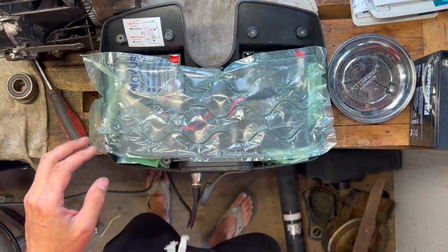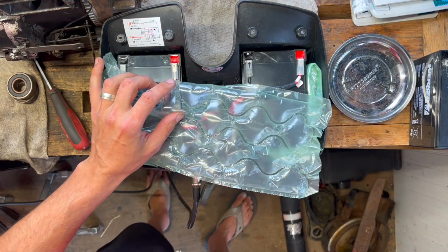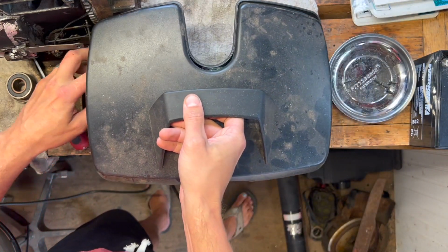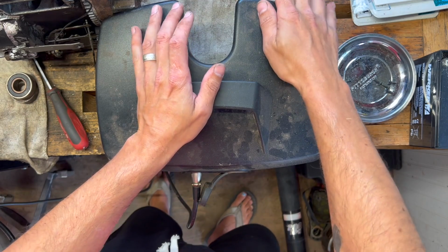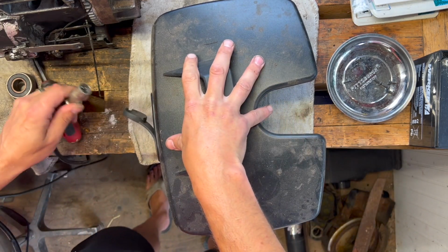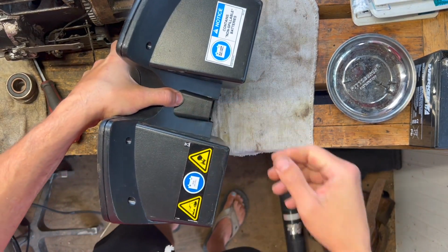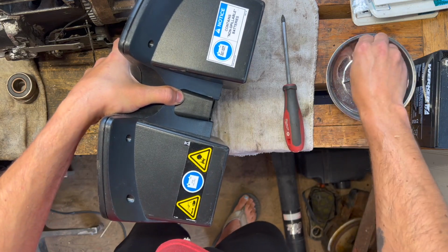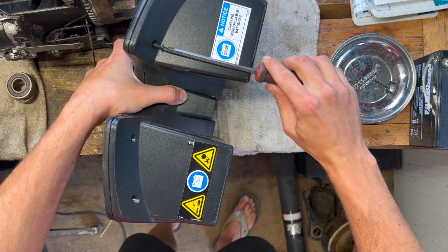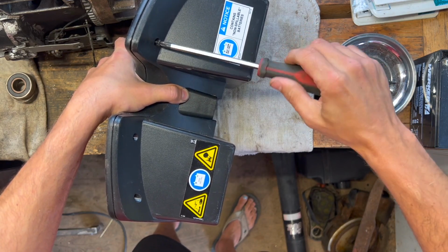That one's over the top. I gotta flip the whole thing over in order to get these back into place. I think that these batteries were originally Velcroed in, because when I took out the old batteries, there was Velcro on the inside of the housing. So that'd be my guess. I'm sure that these batteries have already been replaced. I just want to get a couple screws started so that it doesn't all come flying apart when I flip it over.